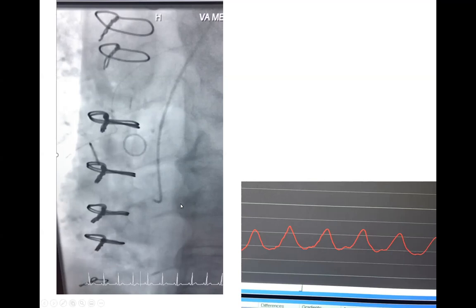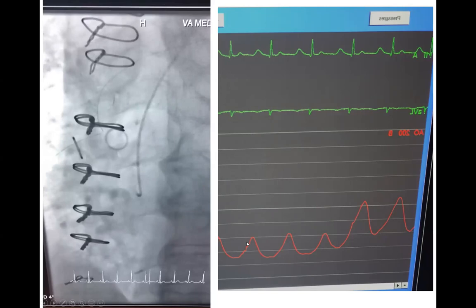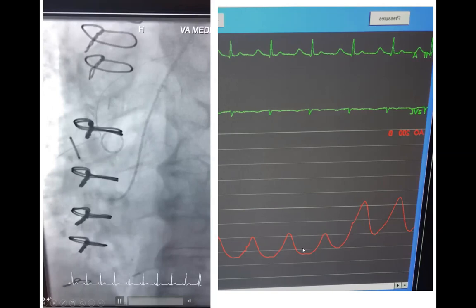Don't inject dye. Since the tip is not too long, you're not deep in the conus branch. If you keep clocking the catheter, you'll end up in the RCA. If it were too deep, I wouldn't keep clocking — I'd counter-clock, disengage, and try a non-selective image or change catheter. Here we kept clocking and jumped from the conus to the RCA, and the pressure normalized.